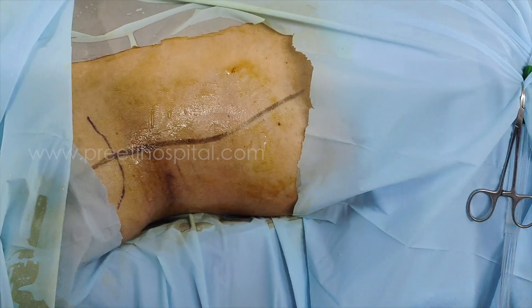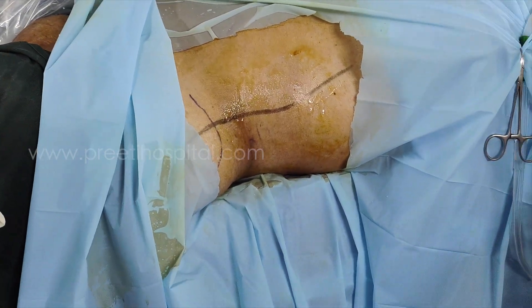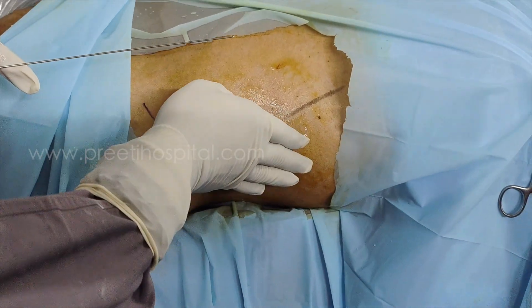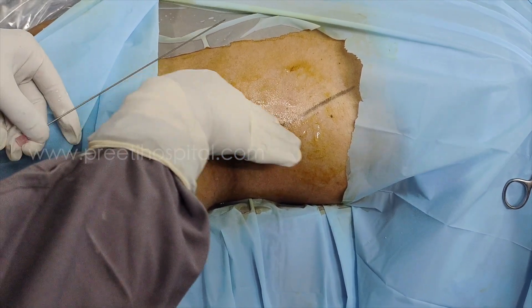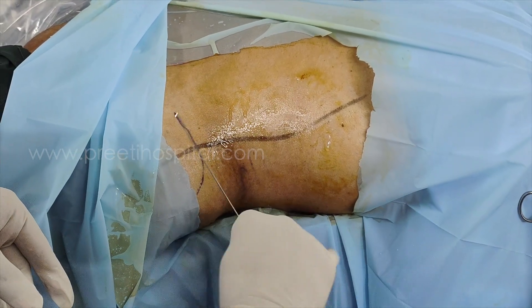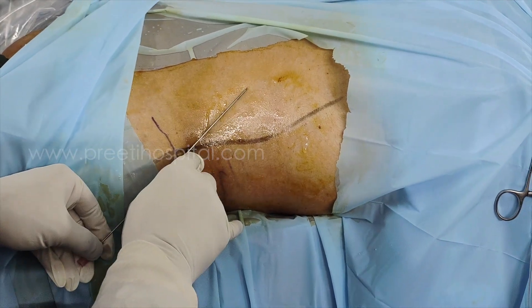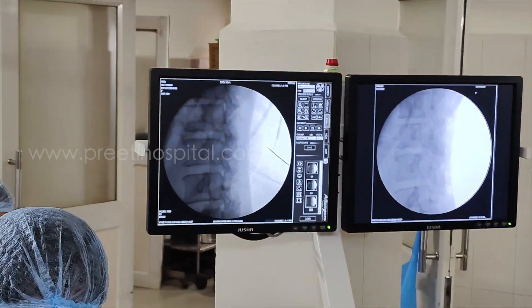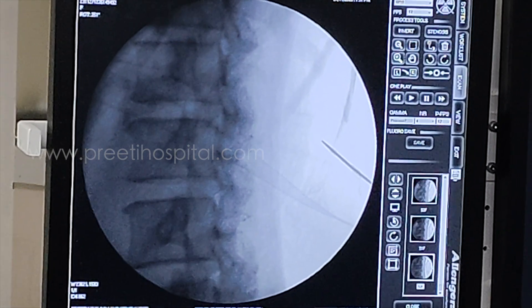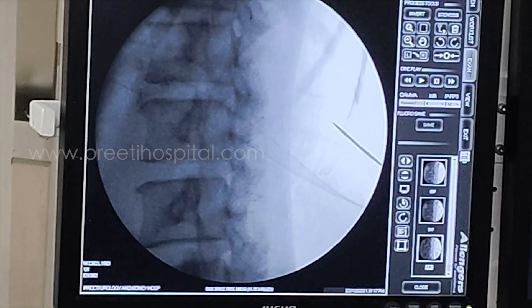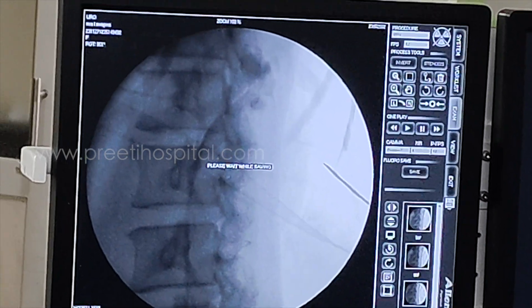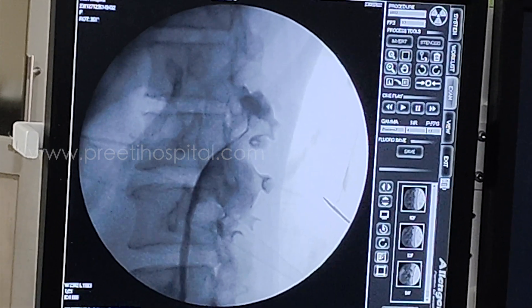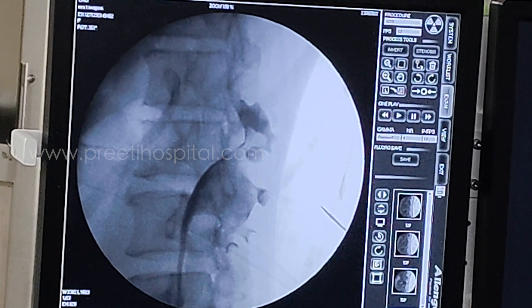In this safe area, what we have to see is whether you put the puncture in this area — the rest of the kidney stone is down. So if you puncture like this, you can work out everything. I will try to position somewhere here and see whether the stone is seen or not. Now, inject the contrast. At this level you should inject contrast. The picture is the lower pole — aim directly at the stone.